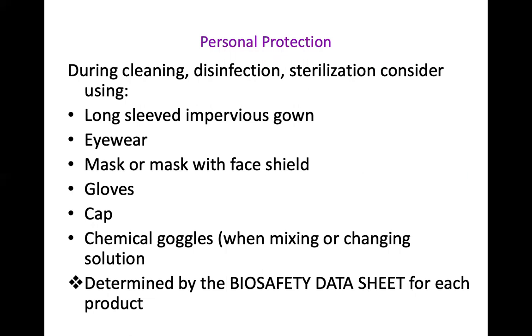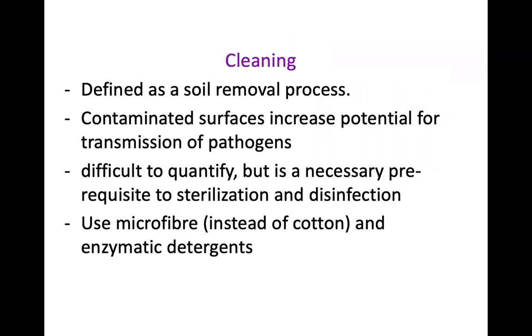What do you need to do? Or if somebody consumes it by mistake, thinking it's water, what do you need to do? That is provided in the biosafety data sheet, and it's very, very important when you're dealing with chemical disinfectants or chemical sterilizers. So going back to cleaning, which I mentioned as an important prerequisite for some of these processes, especially when you're dealing with chemical disinfectants or sterilants, you need enzymatic detergents to carry out cleaning.